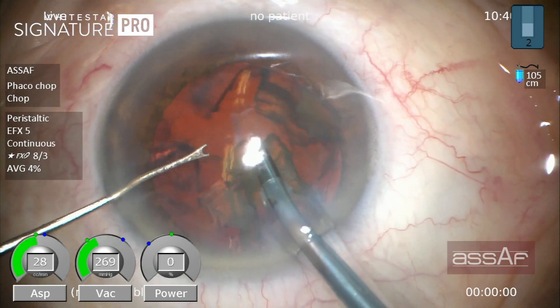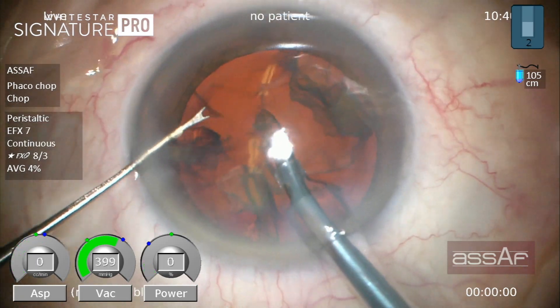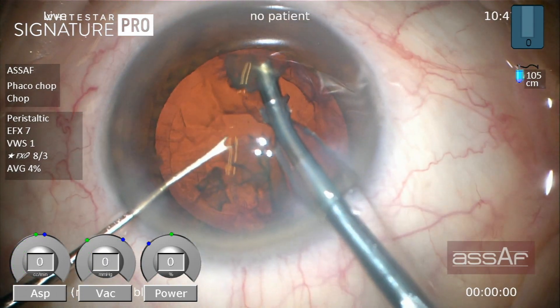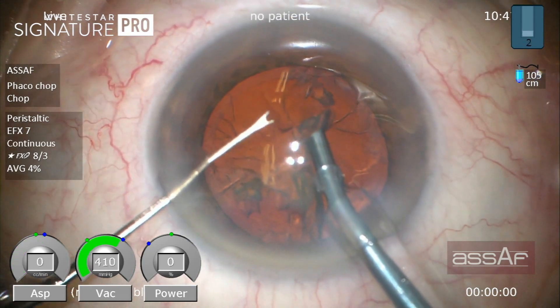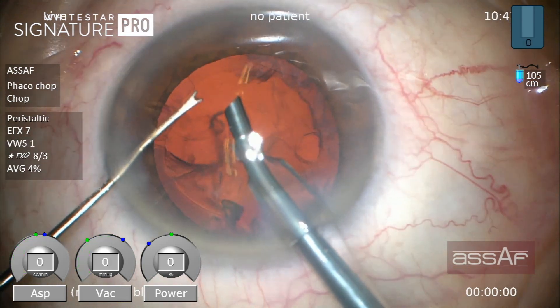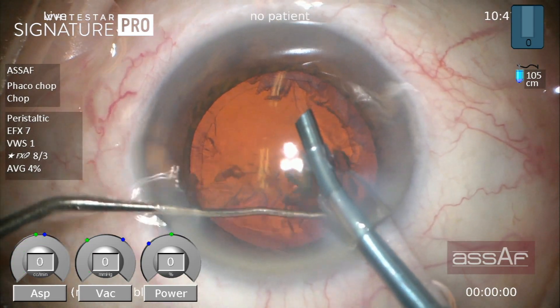This is the last quadrant, and while emulsifying the last quadrant you can see there is nothing abnormal. Then all of a sudden, while emulsifying those small remaining nuclear fragments inside the anterior chamber, the posterior capsule was hit by the tip of the phaco needle. I didn't even realize at that time that I had a complication or break inside the posterior capsule, so I continued with phacoemulsification until I realized I had a complication.